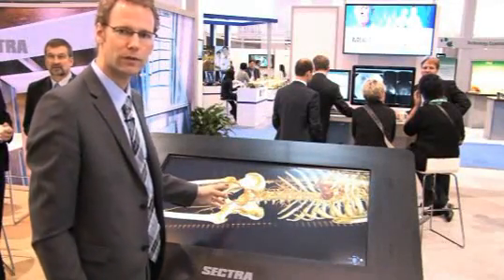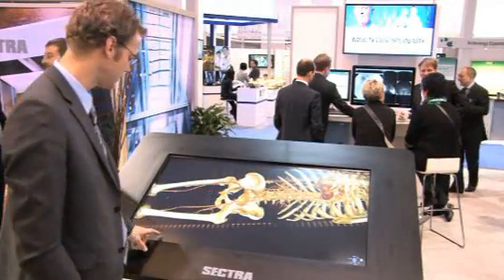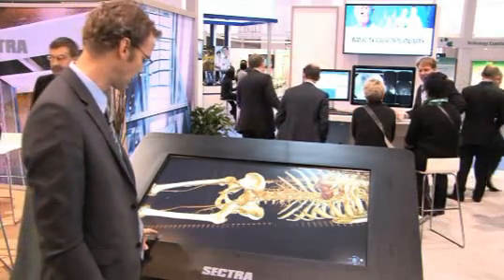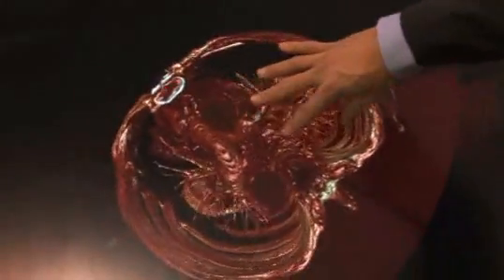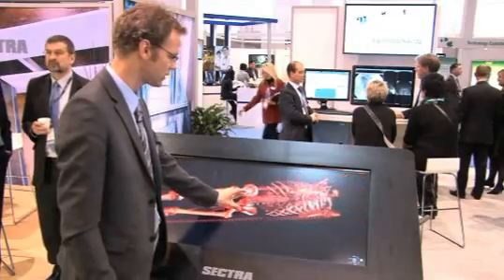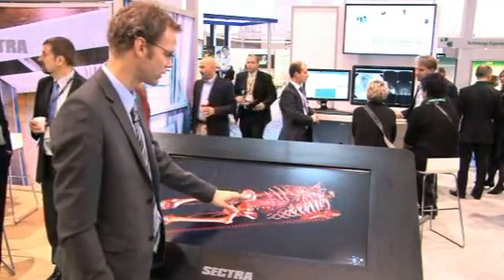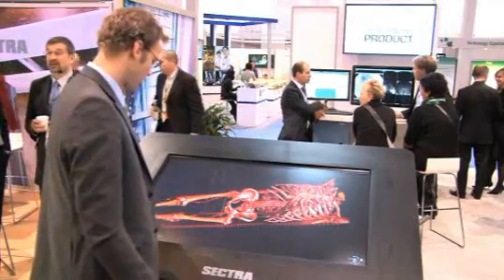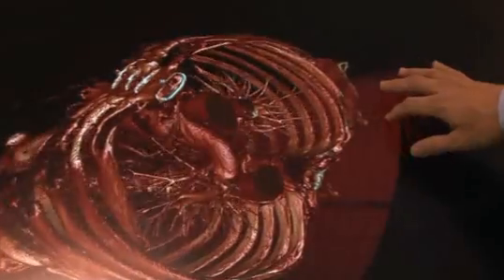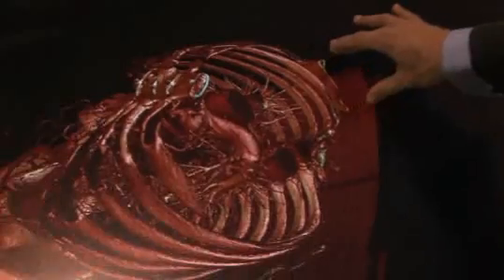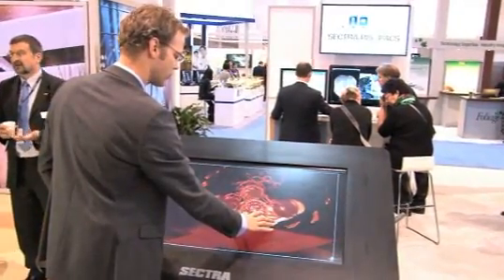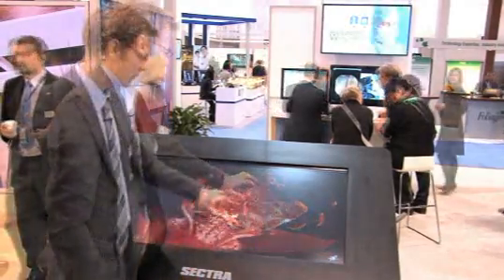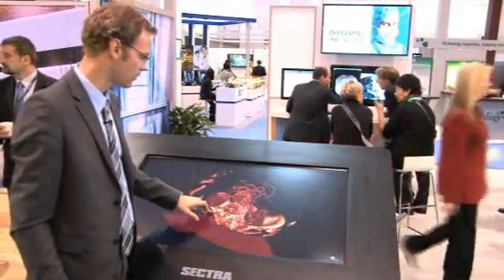To better view different tissues or the anatomy, I can change to different color presets. Here's my map of color presets. Doing this, I can much more easily see the kidneys and the arteries. I will flip up the body and cut through the spine to find any anomalies and get through the arteries to the kidney. Here I can see that the arteries are not affected.